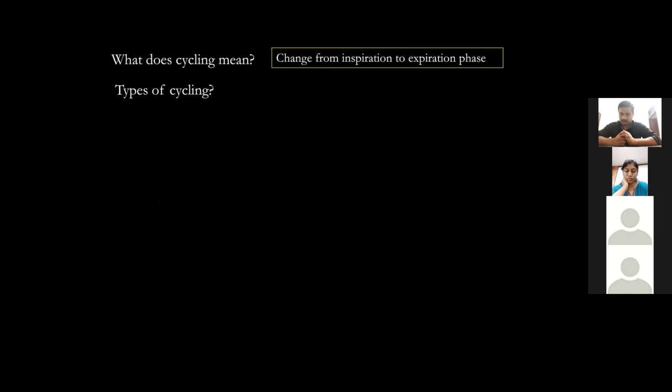What does cycling mean? Dr. Anbumani. Conversion from the inspiratory phase to the expiratory phase. Okay, correct. Next, types of cycling.